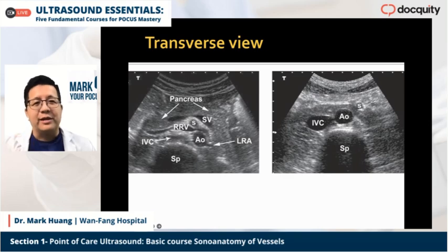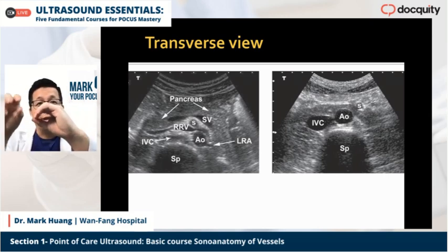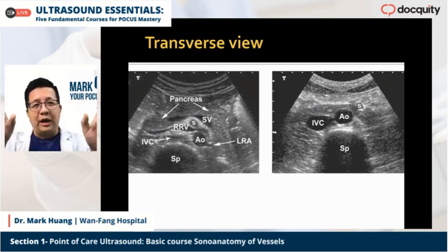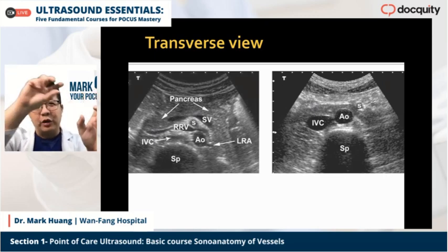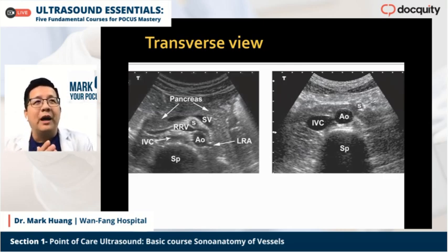From this, almost, I mean, the landmark. Here you see the aorta, and here you see the small tubular structure, the SMA, and above it is the splenic vein. Above the splenic vein, this soft tissue structure is the pancreas. So it's very easy to find systematically, not randomly or incidentally finding this structure and the other structures.